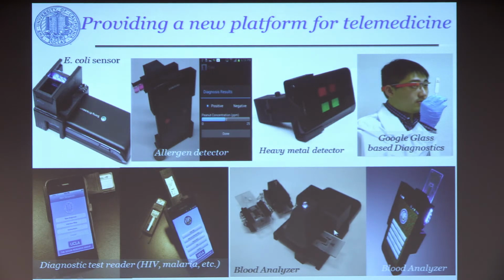So in this regard, yes, there is some drift, some coefficient of variation, but these are tolerable, especially considering the handheld and extremely cost-effective and rapid nature of these tests compared to standard lab routines. Some of the examples are shown here. You can now detect bacteria, E. coli, Giardia, Crypto, specifically and sensitively using interfaces attached to mobile phones.